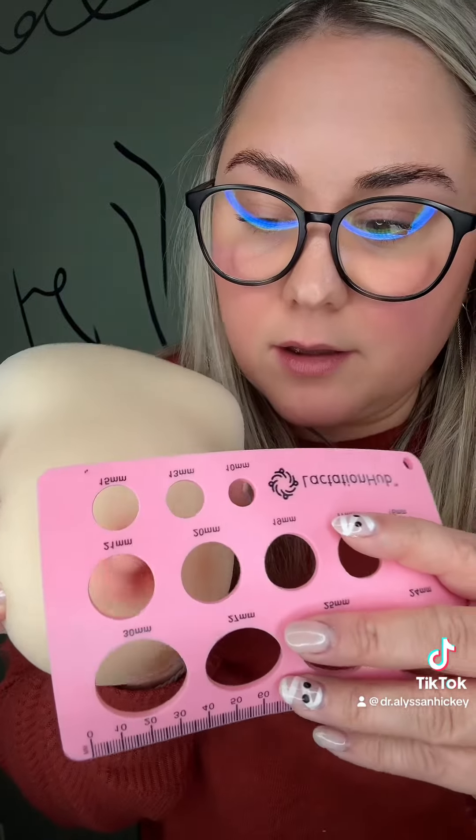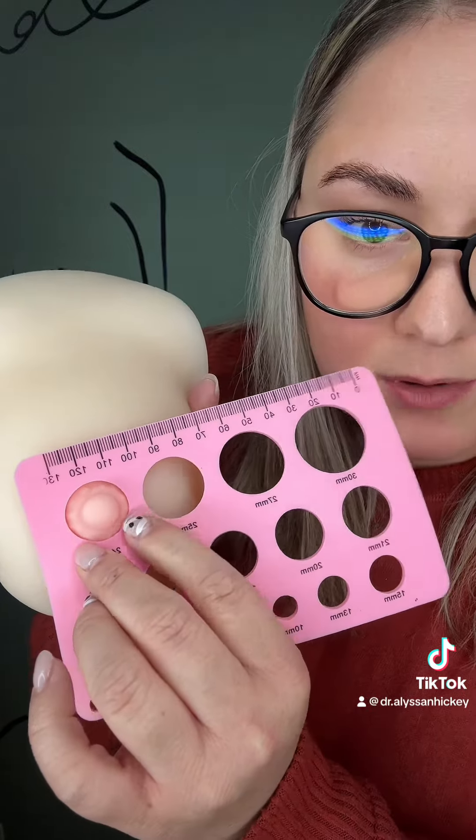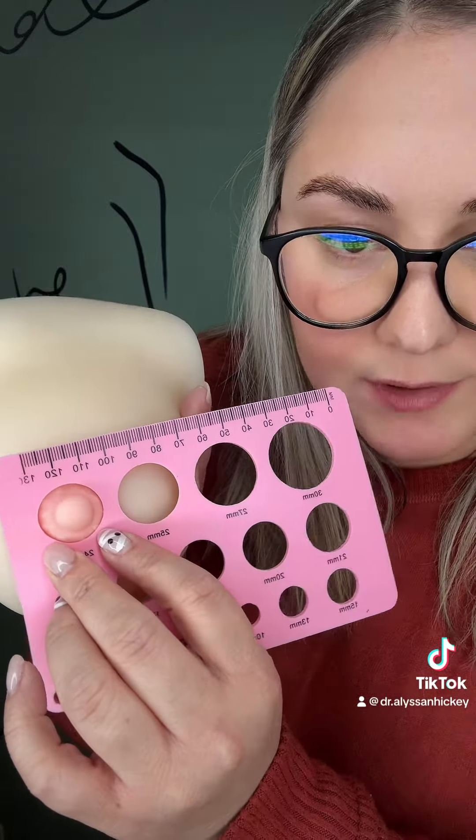What you're going to do is place the measurer over your nipple to get the correct sizing. Most flange sizes are this 24, and you can see how that is going to be pulling in a lot of tissue around the nipple itself.